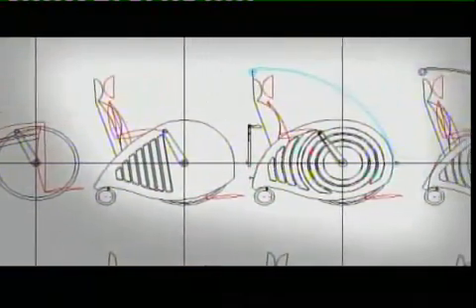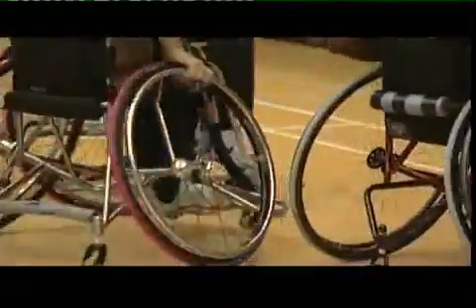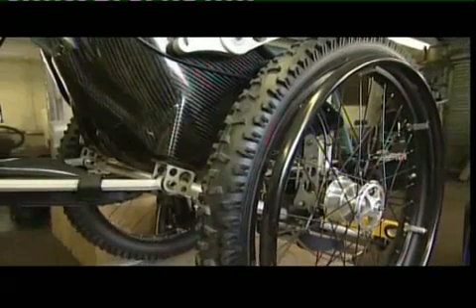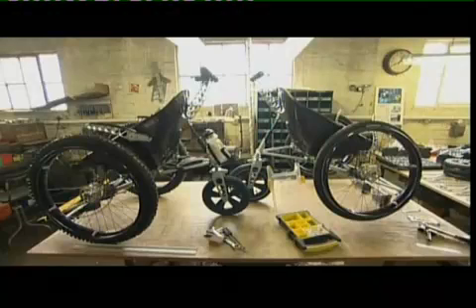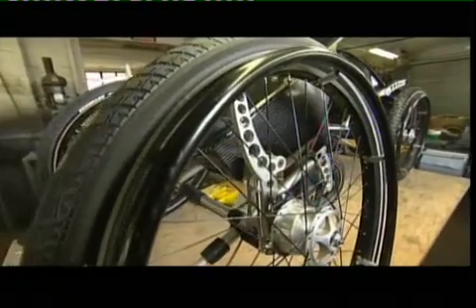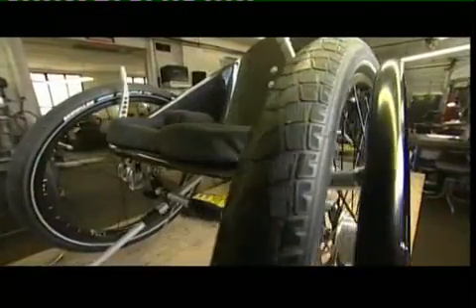If the Trekinetic was going to be truly versatile, it needed to be 2 wheelchairs in one. It obviously needed stability, which would only come if Mike opted to widen the distance between its wheels, like you see on sports wheelchairs. But it also needed to have wheels that were lean enough to fit through doorways. Mike had to find a way that someone with limited movement would be able to alter the angle of the wheels to suit the environment they were in.